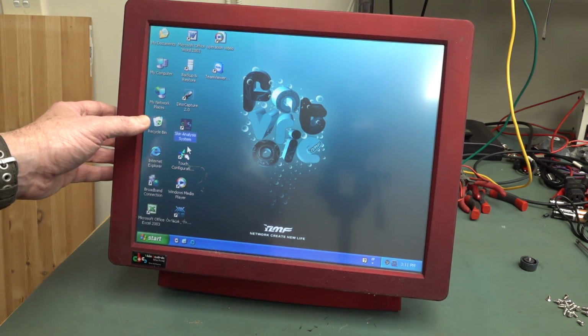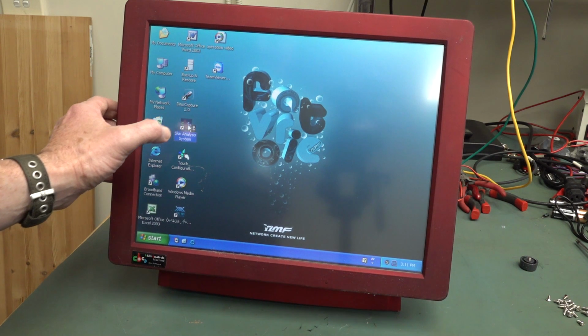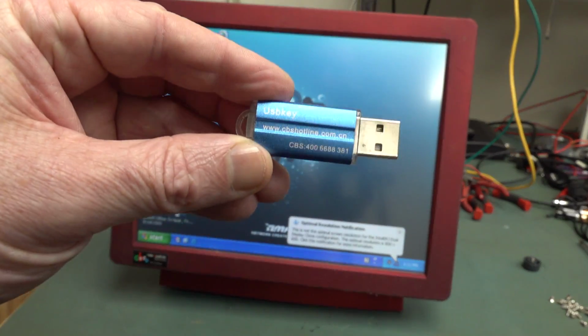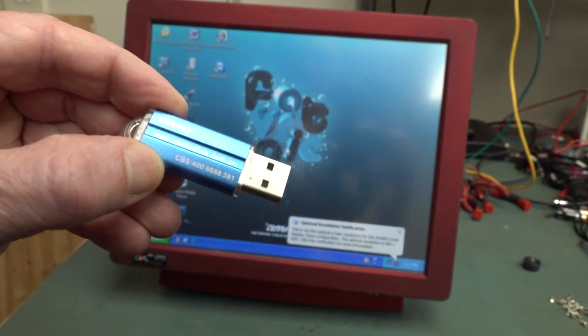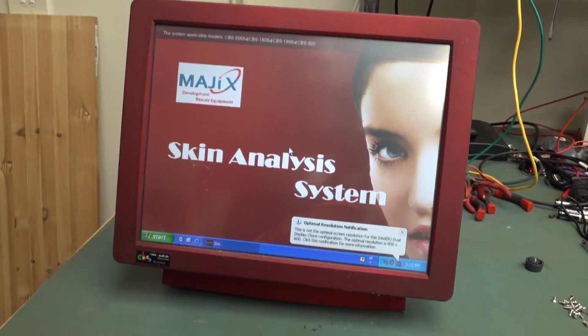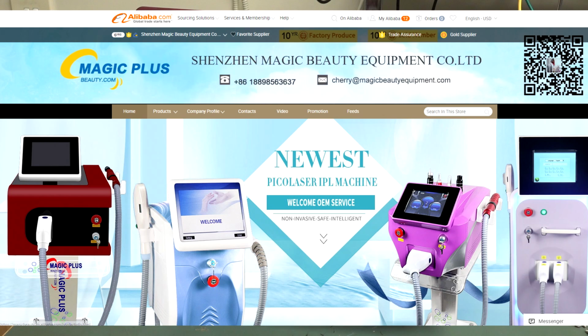Don't know what Dino Capture is, but skin analysis system. Can we double-click on that? And, maybe I don't have the stick in it. Yeah, this is probably a dongle-y thing, so like a hardware dongle. Aha, we're in. There we go. Majix Development Beauty Equipment. System applicable models. It's got all licenses and whatnot. And she looks like she's got perfect skin.